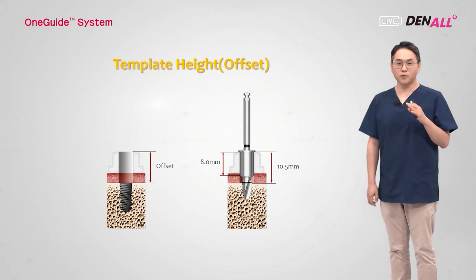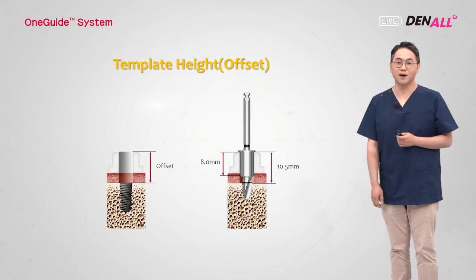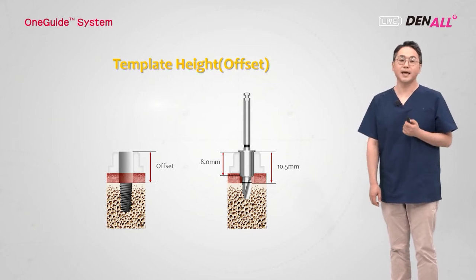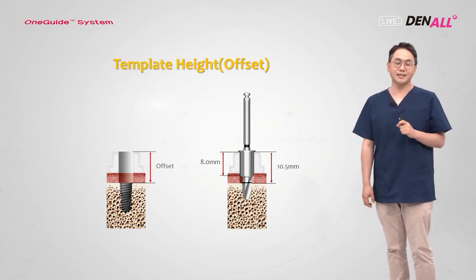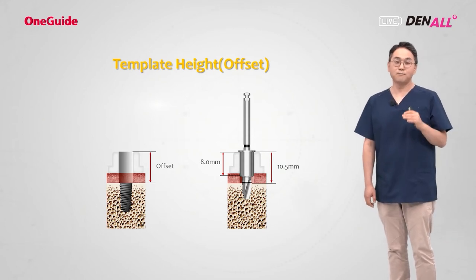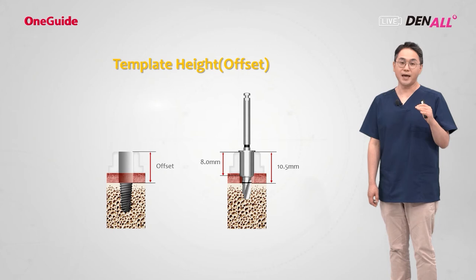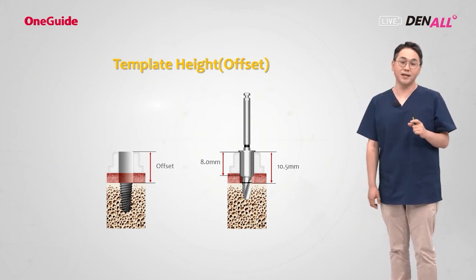People often ask how to adjust the vertical position of an implant using the surgical guide. So we need to understand the concept of the offset. Many dentists believe the thickness of a guide hole is the offset, but that is not true. Offset is from the top of the implant to the top of the guide hole made.